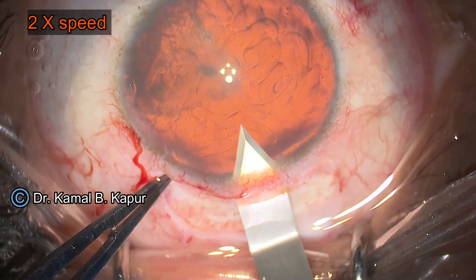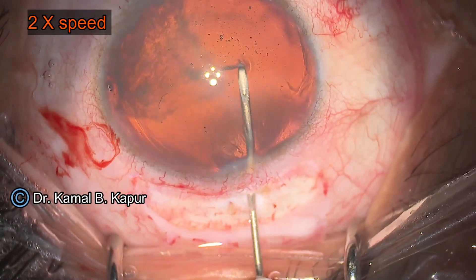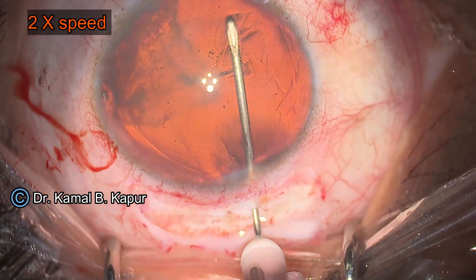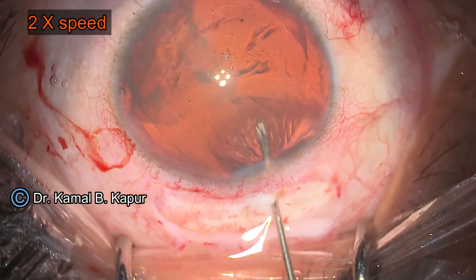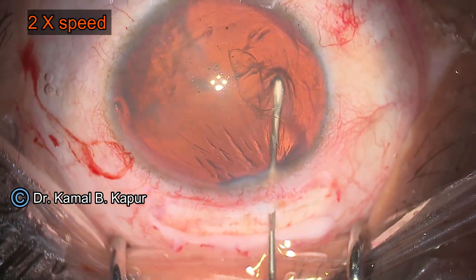These haptics are very brittle — any amount of extra force can cause breakage of the haptic, so we have to be very gentle. While doing the capsulorrhexis, a few things to remember: since these haptics are made of PMMA, they cannot be folded or bent like hydrophilic lenses or three-piece lenses.